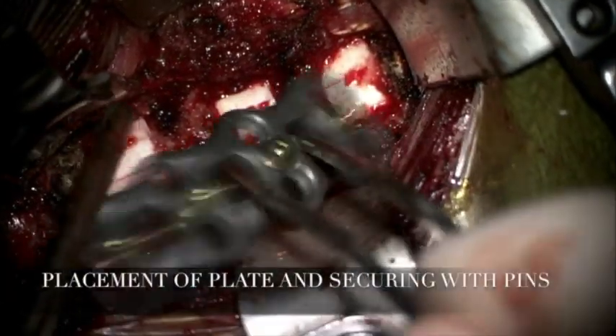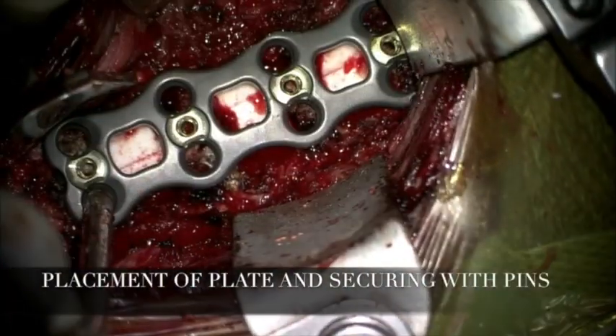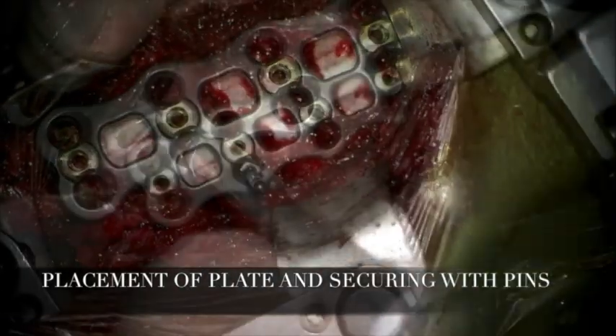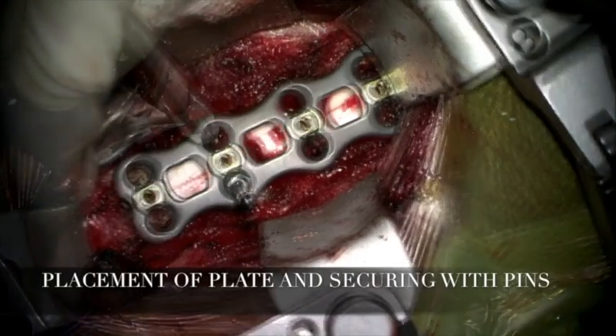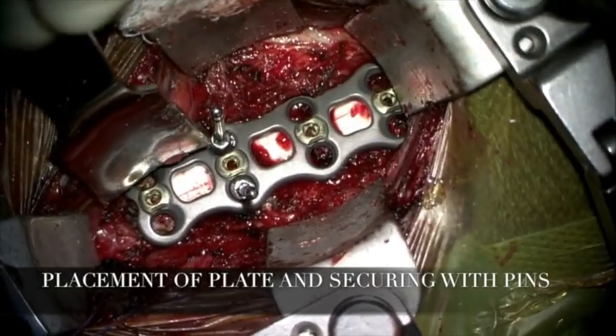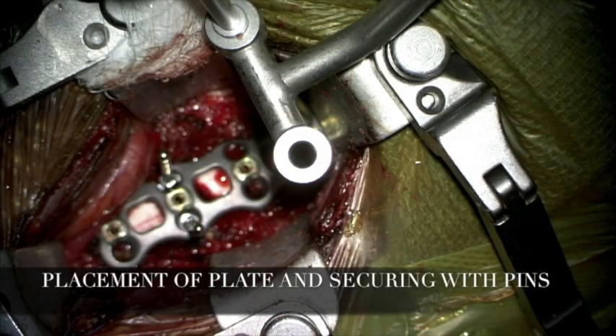We then placed the plate in position, making sure that the plate was fitting well and stable along the anterior surface of the cervical spine from C4 to C7. The plate was positioned a few millimeters below the superior endplate of C4 as well as above the inferior endplate of C7. To confirm the plate was in the midline, we assessed the distance between the uncinate processes and the plate at all three levels.